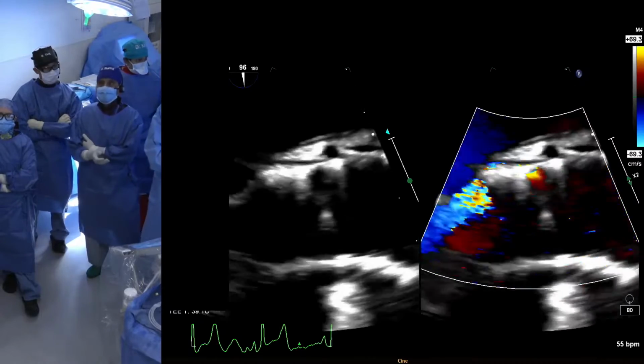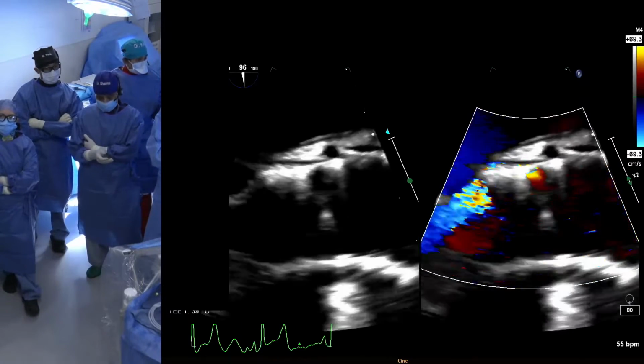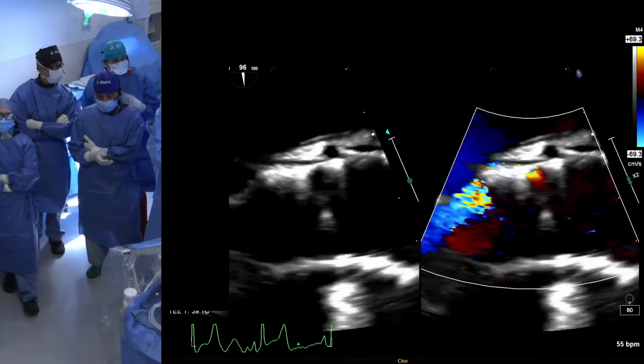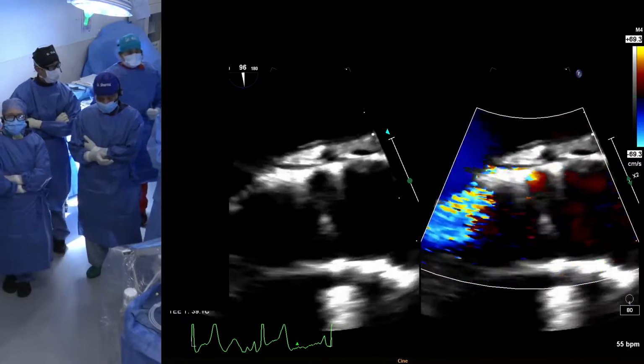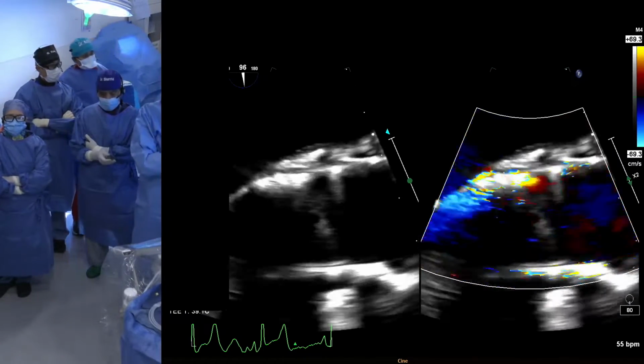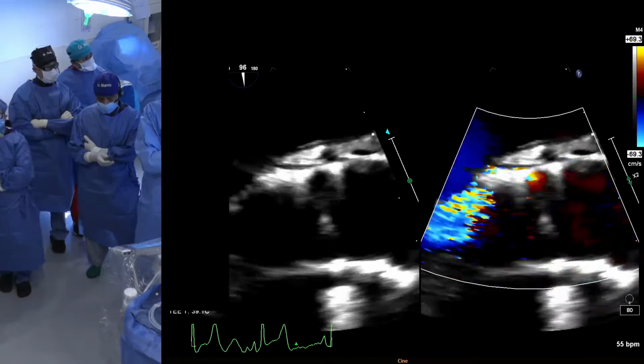You remember, we were discussing 23 versus 26. I don't think 26 is the answer here. That's correct. That's why we had to use 23. There's no choice. It has to be 23 and fully expand it. Yes, expansion before, so that the frame is fully opposed, and then put the same size 23 again.